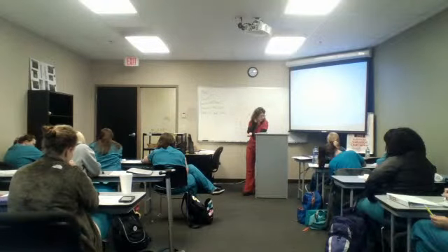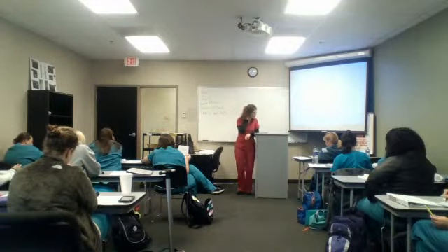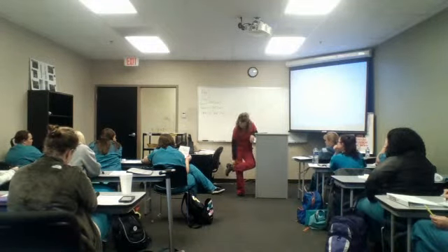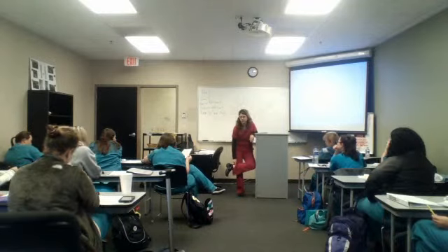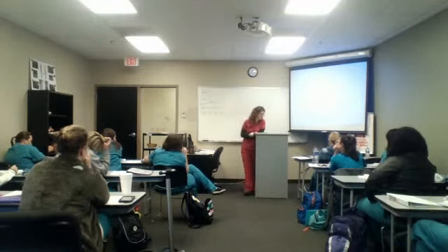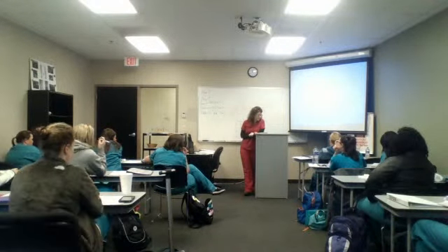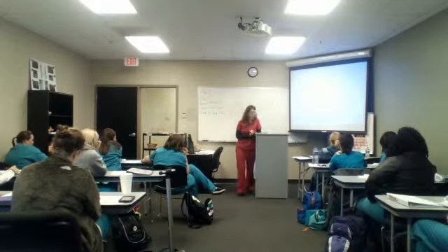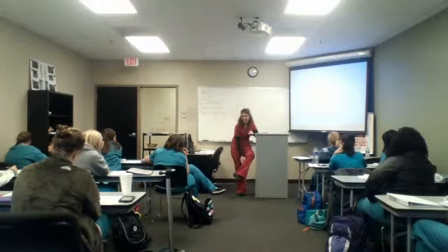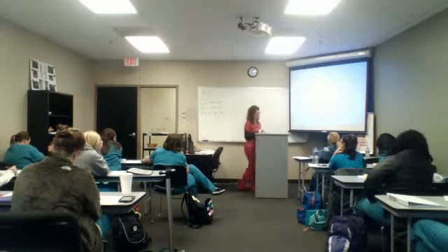Now, to find the posterior tibial vein, you will put your probe medial to your ankle bone. So on the inside of your ankle bone, that's where you're going to find your posterior tibial. And then your peroneals, you put it in the medial calf, like the real thick part right here. That's where you're going to put it. And like I said, when we get to scanning, we'll talk about that a lot more.